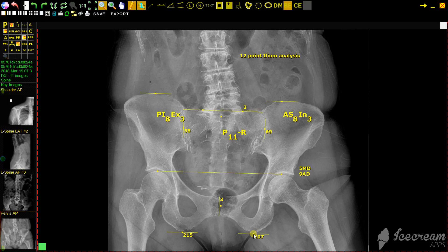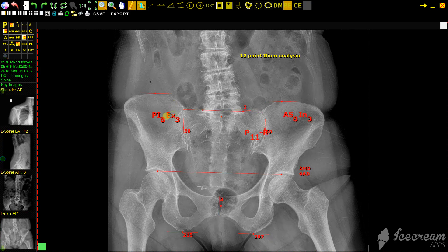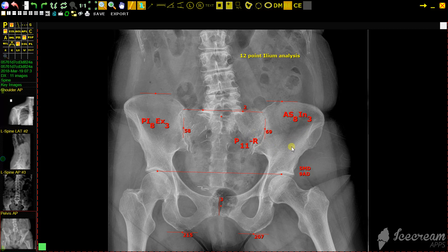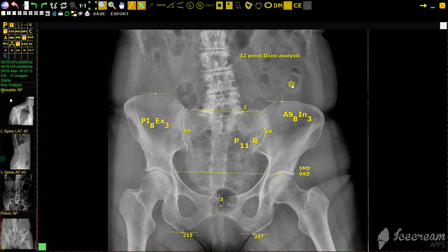As we make the final twelfth click, the markings will appear, and by hovering over the findings, you can move them to however you want to place them. Make a final click, they will turn yellow, and your 12-point ilium analysis is complete.